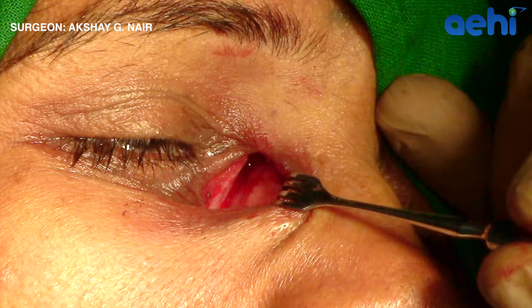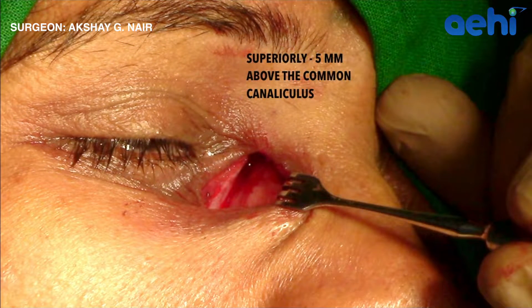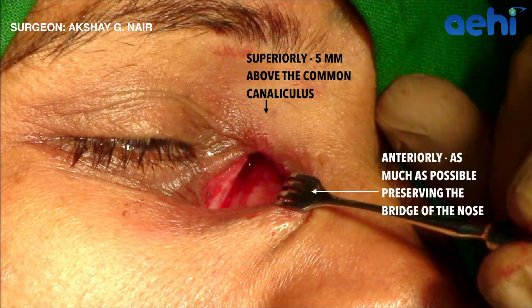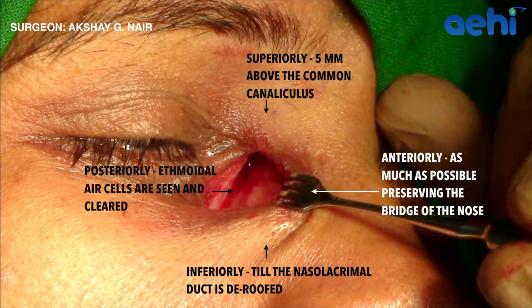Here, the pink nasal mucosa can be seen. But how large an ostium is actually large enough? I prefer to punch superiorly 5 mm above the common canaliculus, anteriorly as much as I can, inferiorly till the nasolacrimal duct is deroofed, and posteriorly till the ethmoidal air cells can be seen and removed.